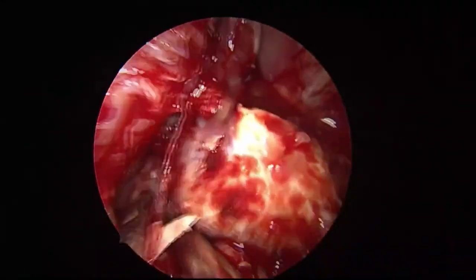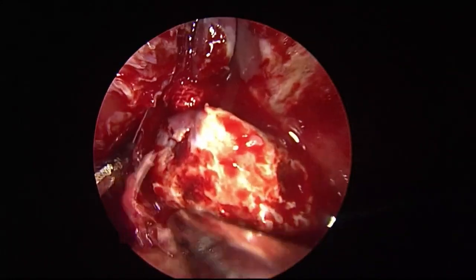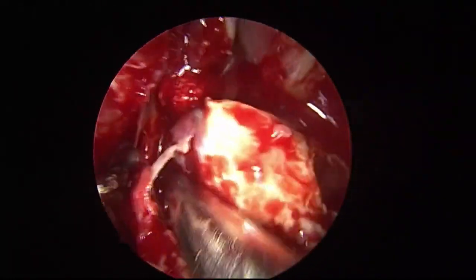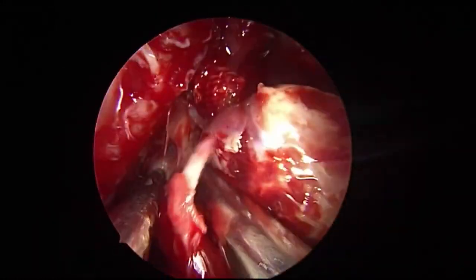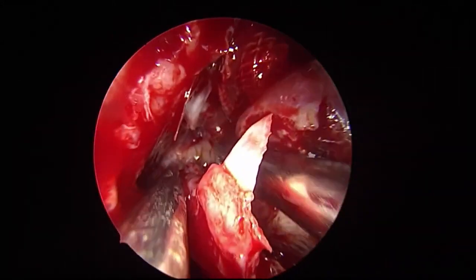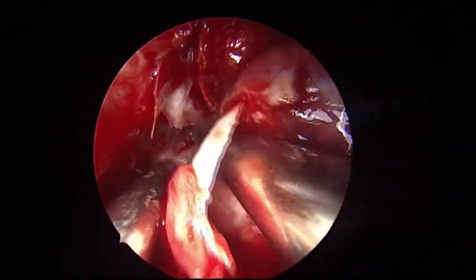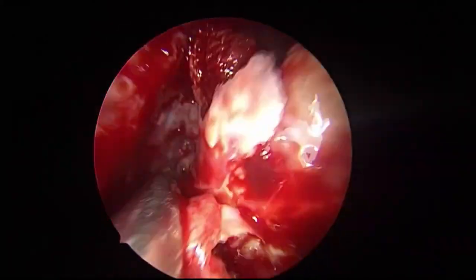Thinned out. That's the uncinate process behind.